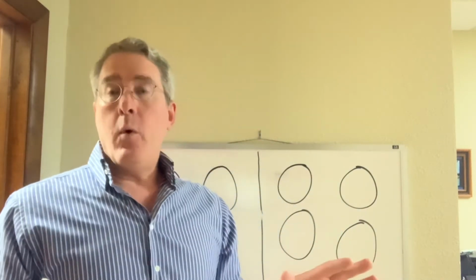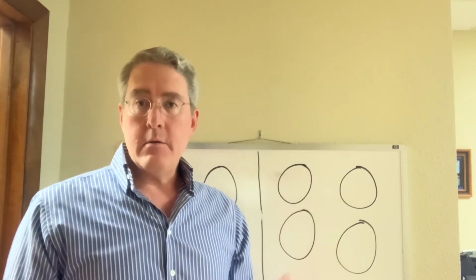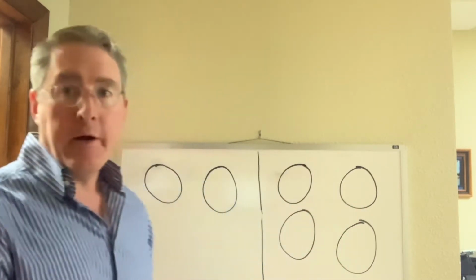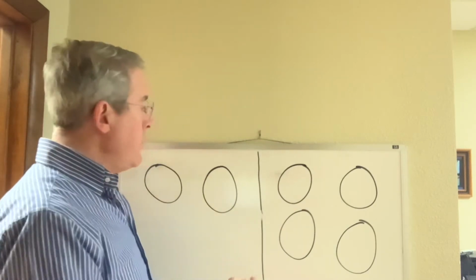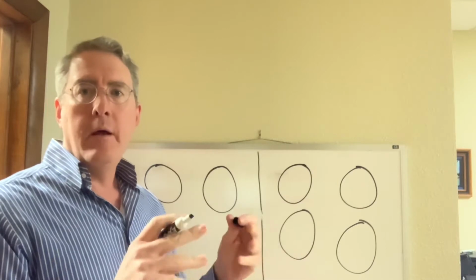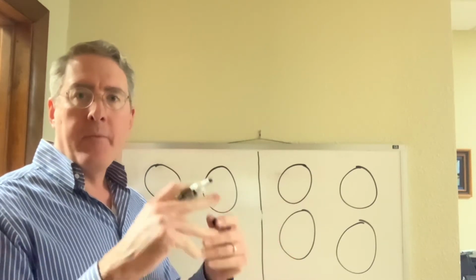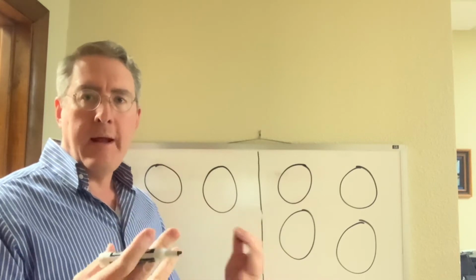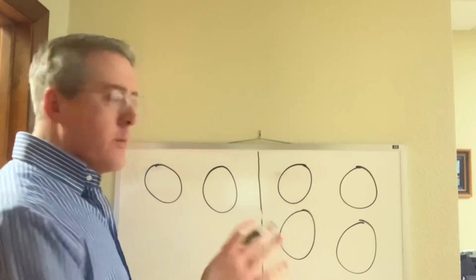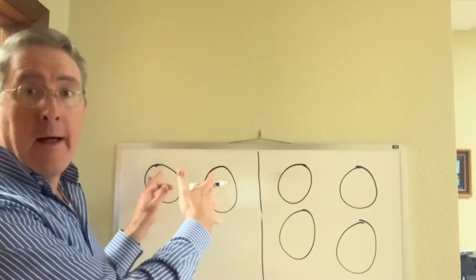So to understand why we're checking each quadrant and what that means, I'm going to use some pictures over here. To understand this, you first have to understand how we document visual fields, and second, how the structure of the eye relates to what you obtain from a visual field. We always draw the visual fields as if we are the patient and we're looking at the paper.